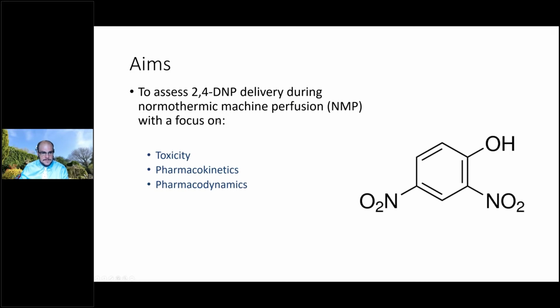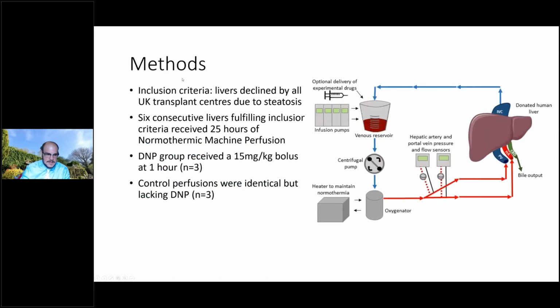And so the aims of his study were to look at DNP delivery, to look at the potential for defatting the livers. But in this study in particular, it was looking at whether there was any toxicity from this, and then trying to figure out the pharmacokinetics and pharmacodynamics of this compound in the circuit, so we can then look at trying to keep a constant level.